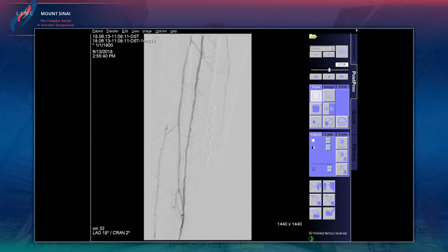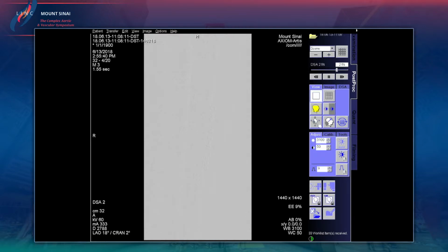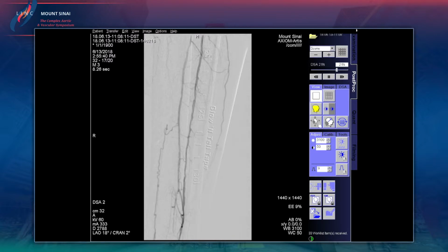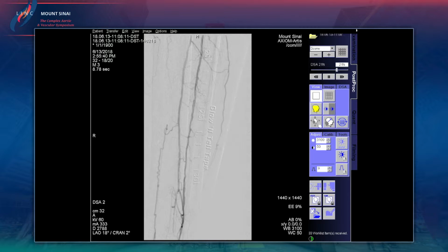See, when the lesion looks like this, Marianne, this far down, especially from 20 to 30, I tend just to make one pass rather than two, because I believe that's an area that I'm positive has been worked on before, and that's probably multiple areas of dissection. So I worry about perforating. So I'm going to just go with one pass from 20 to 30, and then do a prolonged balloon, or even a chocolate balloon at that stage.